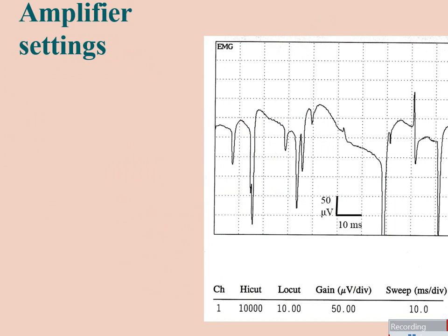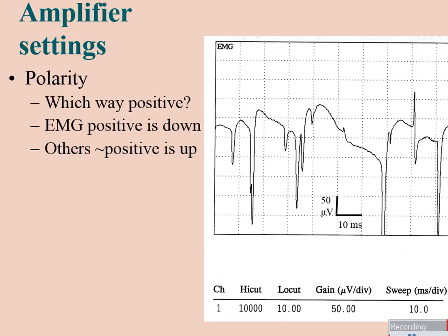Okay, so we've got the patient wired up safely. Now we're going to start amplifying things, and we have to look at what the settings are on our amplifier. The first consideration is, what is the polarity? Which way is up? It seems intuitive enough.